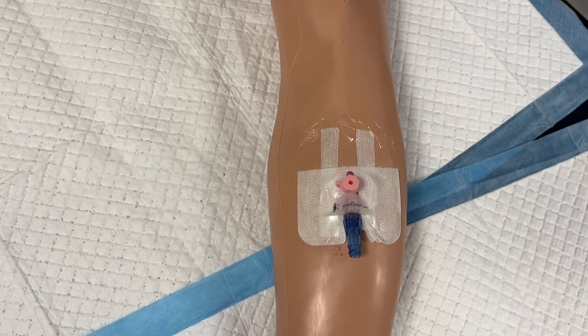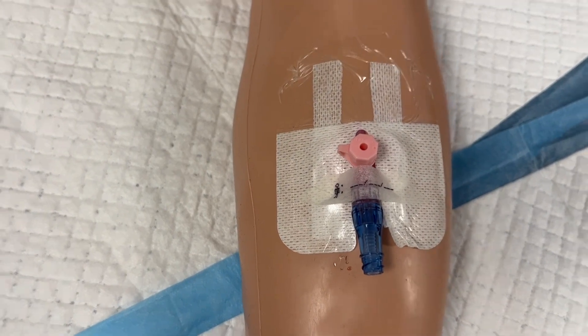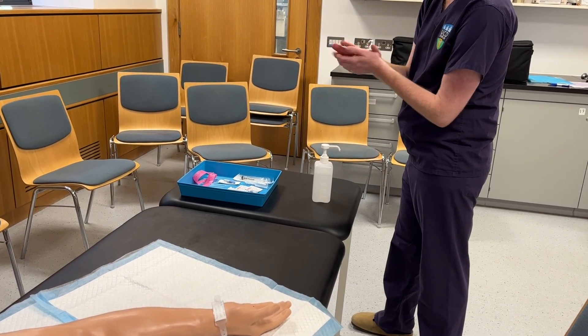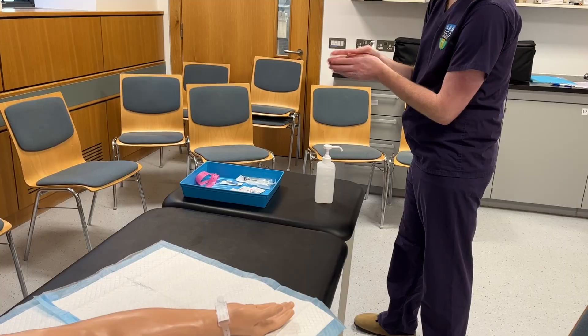This video will demonstrate and explain the insertion of a peripheral IV cannula. After gaining consent from the patient, begin by sanitising your hands with alcohol gel and setting up a tray with the equipment needed.